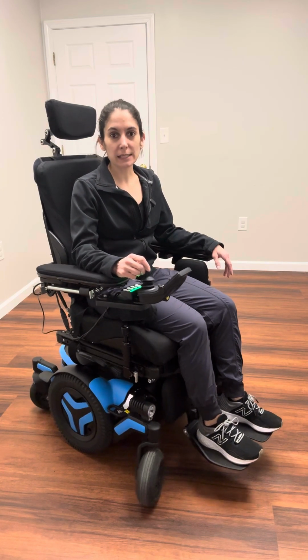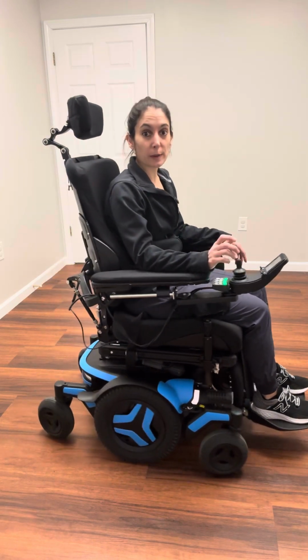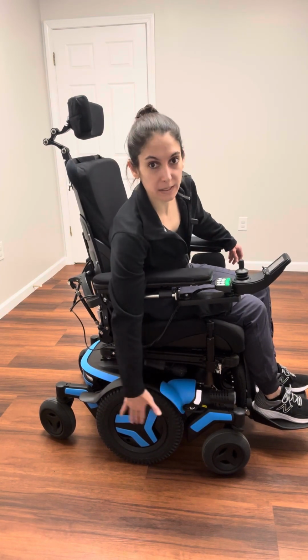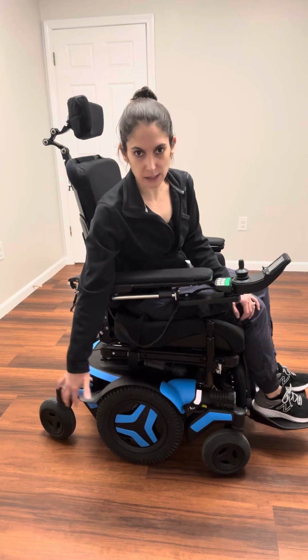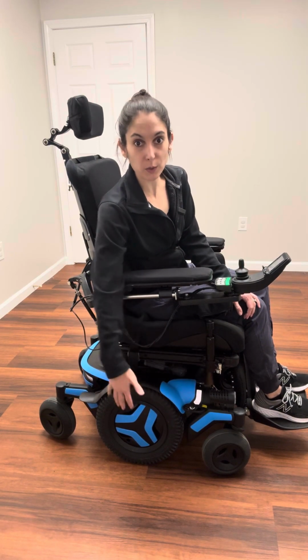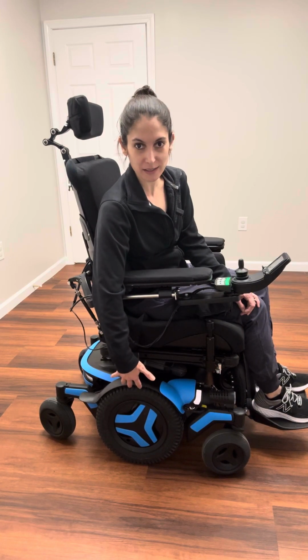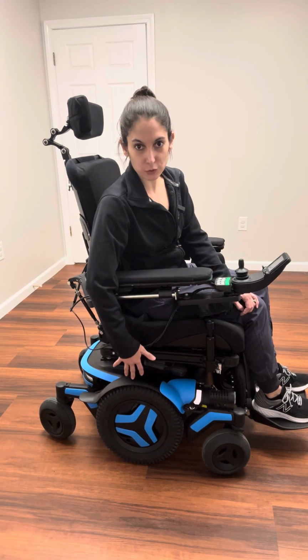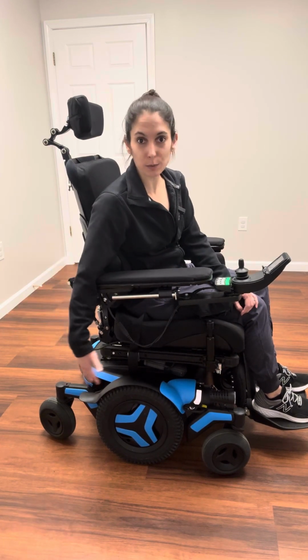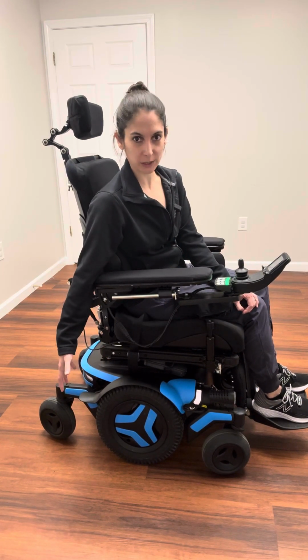So the way you can tell the drive system just by looking at the chair is by looking at where the big wheel is. As you can see right now, on the side, you can see three wheels, and one is significantly larger than the rest. So this is a mid-wheel drive chair. If this big wheel was in the front, it would be front-wheel drive. If it was in the back, it would be a rear-wheel drive chair.